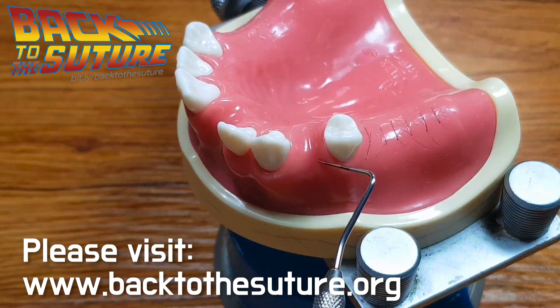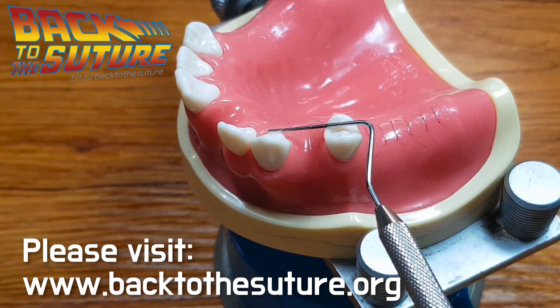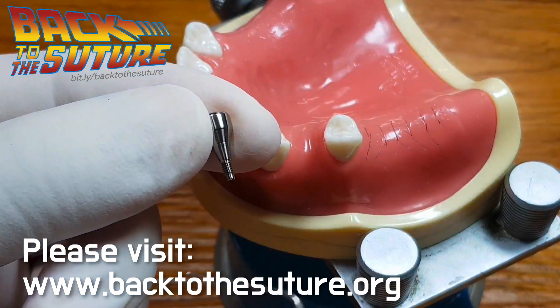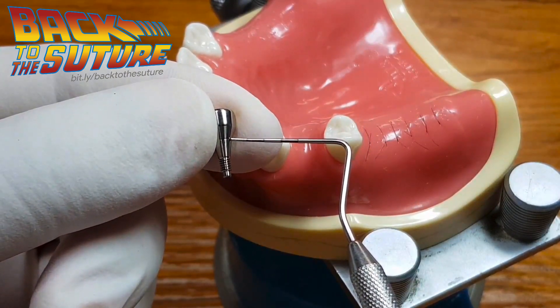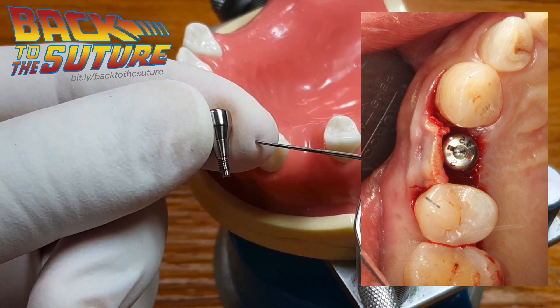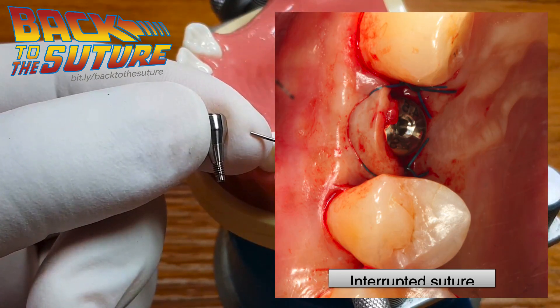When you place implants in an area like this, you may place the mid-crestal incision or slightly lingualized incision. Sometimes if you are a periodontist or if you want to leave the soft tissue to the adjacent teeth, you may place a very small flap design called a paramarginal incision. The problem is when you place the implants and connect the healing abutments, the soft tissue on the buccal aspect — if you do your best to tug the soft tissue underneath the healing abutments — since the healing abutments have a very smooth surface, the soft tissue will tend to climb up the healing abutments and you will lose the soft tissue volume on the buccal aspect and also lose the keratinized tissue. So how can we prevent it by changing the suture technique from interrupted suture to flap folding suture? I will show you how to do it.